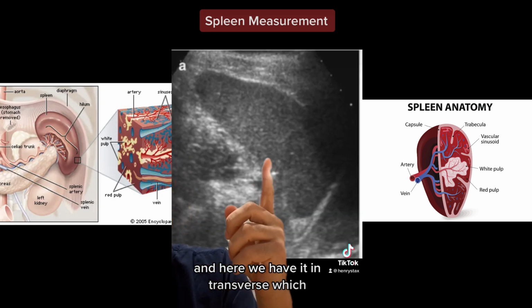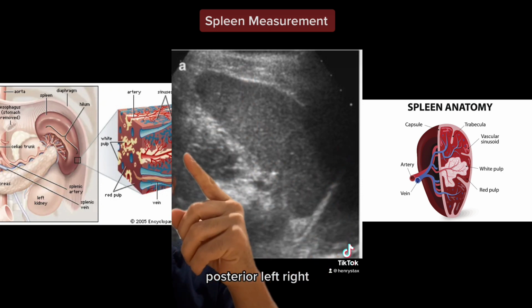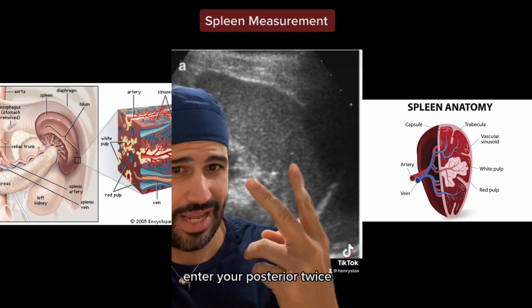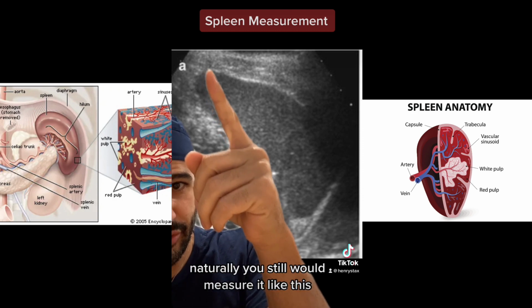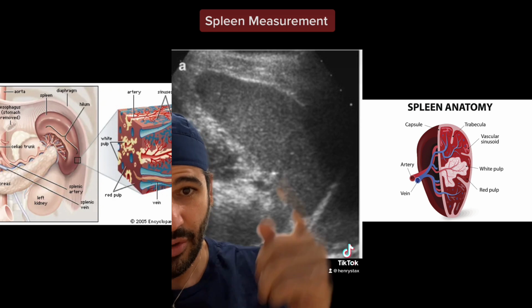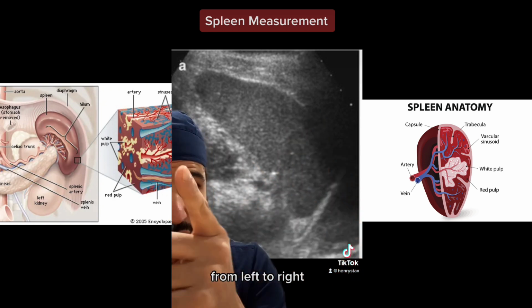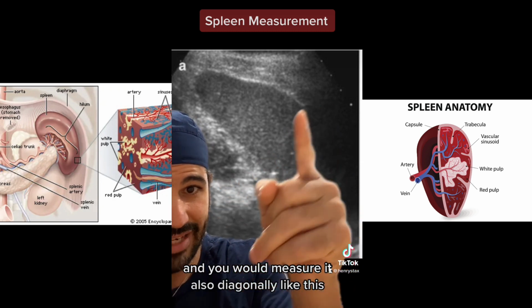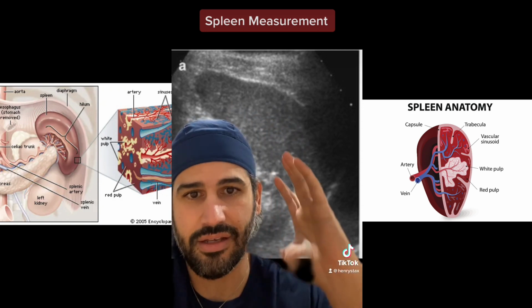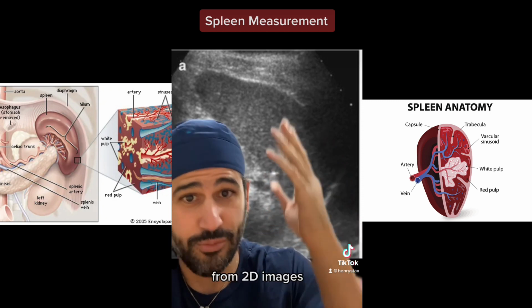And here we have it in transverse, which in transverse, this is anterior, posterior, left, right. So if you measure from here, you're still measuring anterior posterior again. So you'll be measuring anterior posterior twice. Naturally, you still would measure it like this diagonally to get the full length of the organ. Whereas if you measure from here to here, this is transverse, from left to right, and you would measure it also diagonally like this. So I do understand the confusion, and sometimes it's hard to get a 3D representation in your brain of internal organs from 2D images.